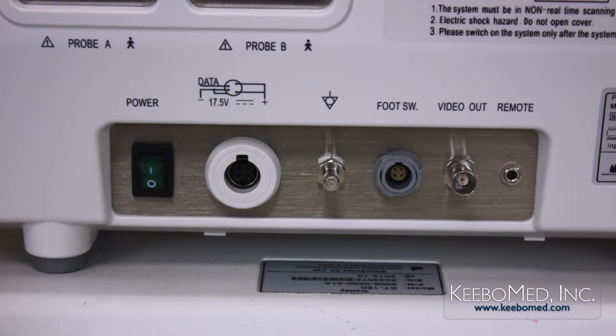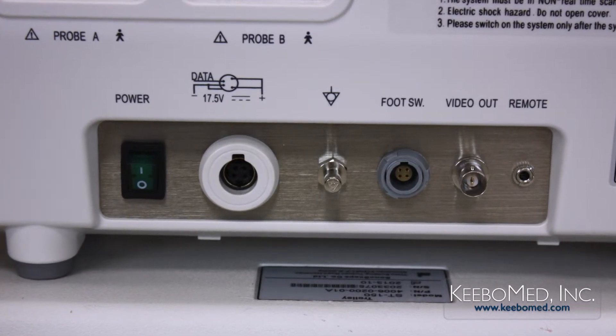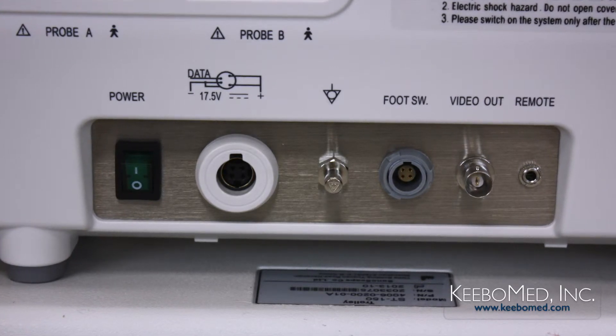On the back of the A6 is a video printer controller port, a video out port, a foot switch port, a grounding terminal, a DC power socket, and the main power switch.